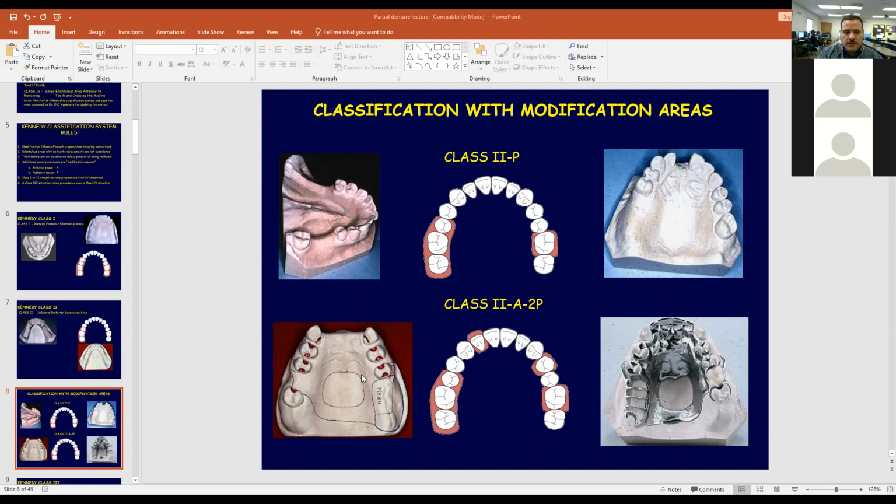The other thing is the movement. Partial denture should be rigid and should not make any movement. If it rocks, it will harm the remaining teeth because these teeth are holding the partial denture. Every time it moves, it will damage them. And if you remember, the tooth is suspended by ligament, and with too much pressure on the ligament, you will have destruction of the ligament. You will have periodontal pockets, losing of the teeth, and the patient ends up with a complete denture.